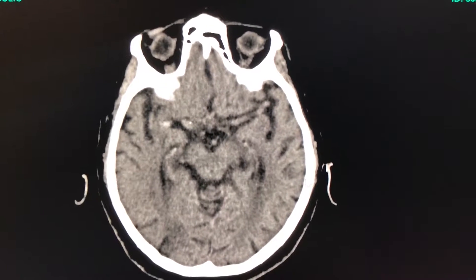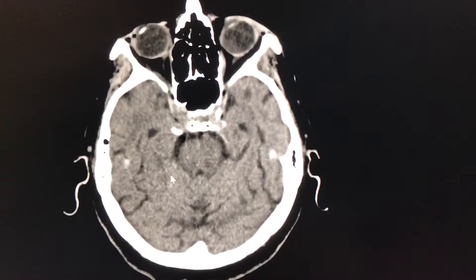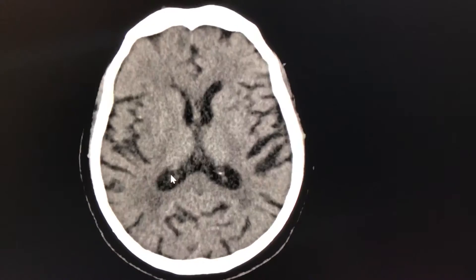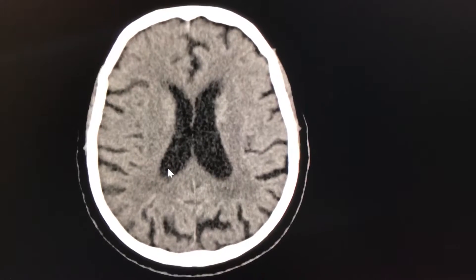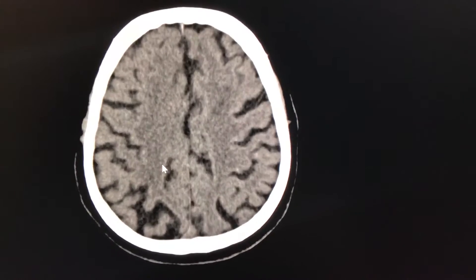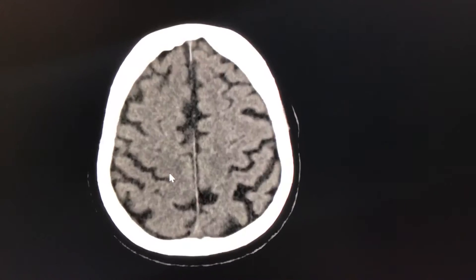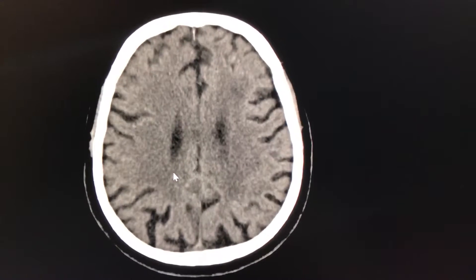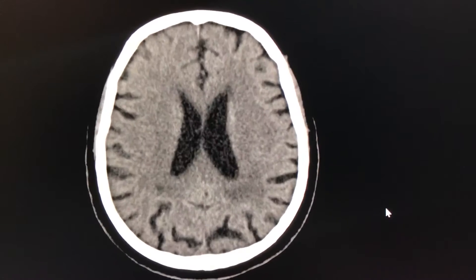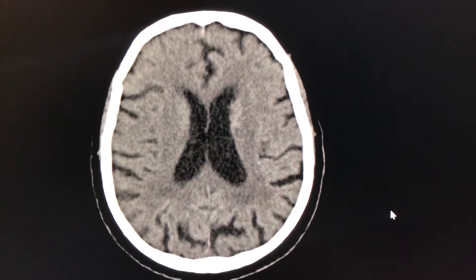This is the earliest sign of right MCA territorial infarct, and we can confirm that by seeing that we have very little ischemic changes or hypodensities appreciated on this CT, where we know we have a patient with left hemiparesis in the setting of a hyperdense right MCA sign, and therefore thrombus material within the right MCA and a right MCA territorial infarction.